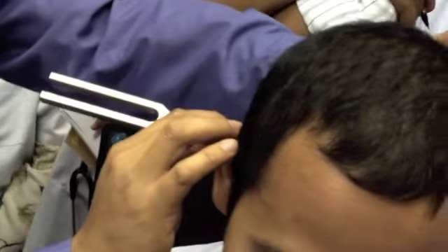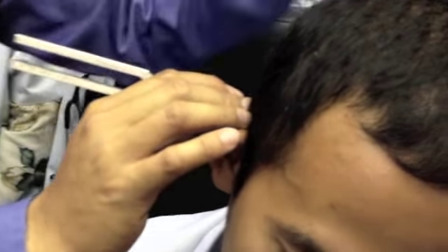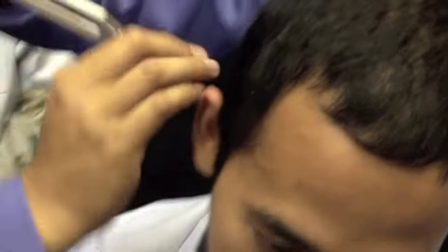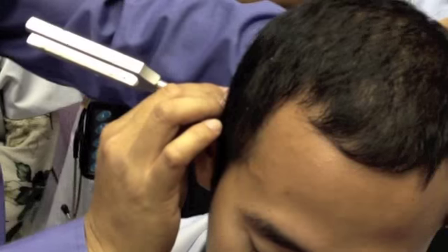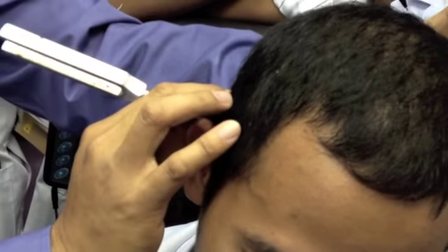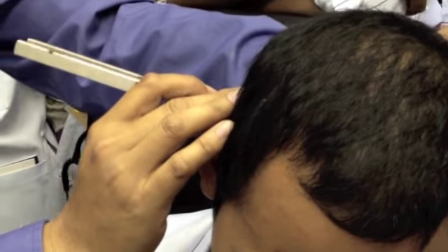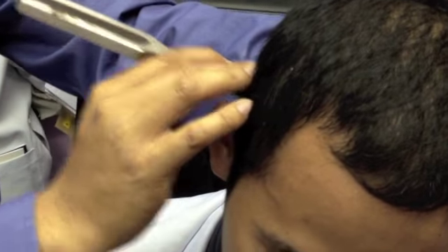If you do macam tu, tak rasa, patient takut. Alright, you just firm. Maknanya dia kemas, relax, dia vibrate nicely. Too hard, vibrate and you also vibrate. And then patient just soft and nothing lah. Alright, so buat macam tu.